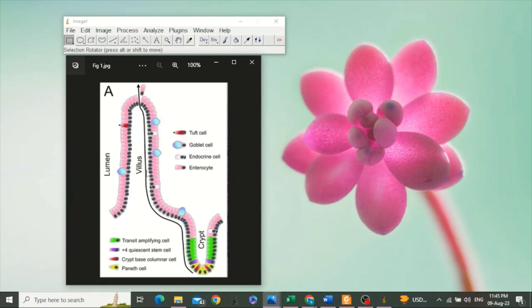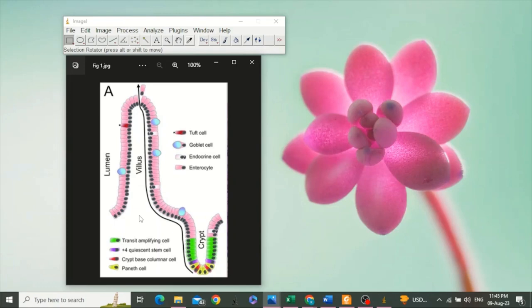The villus height is measured from its top to its base. At its base, it is attached with the submucosa. Villus width is measured at the middle part of the villus, at this position.